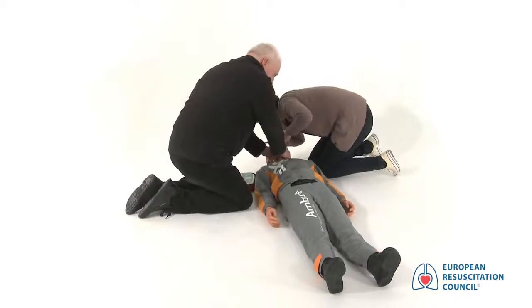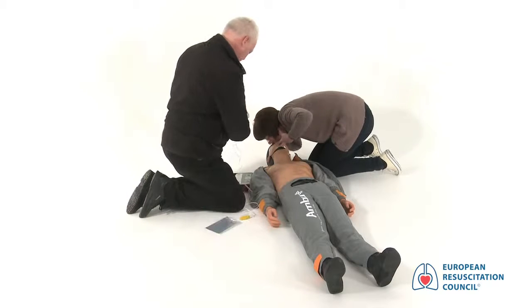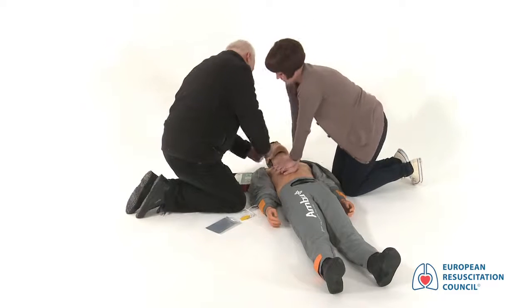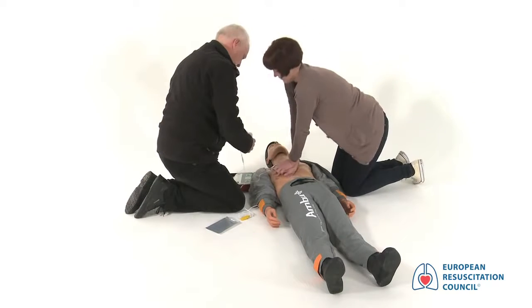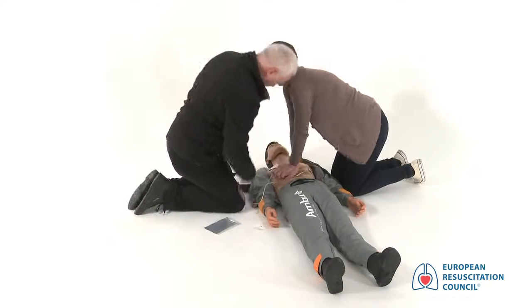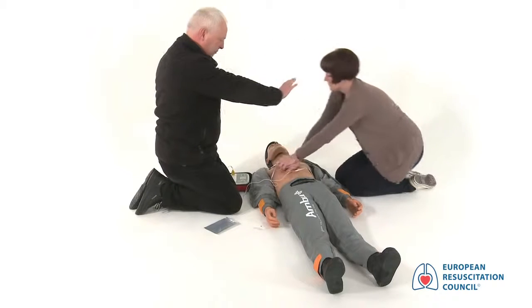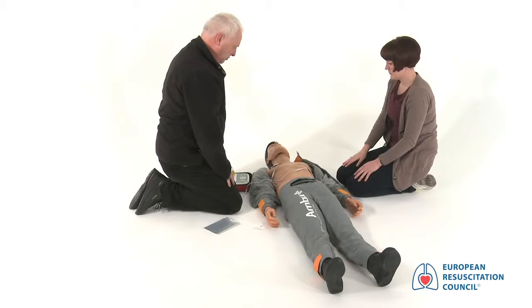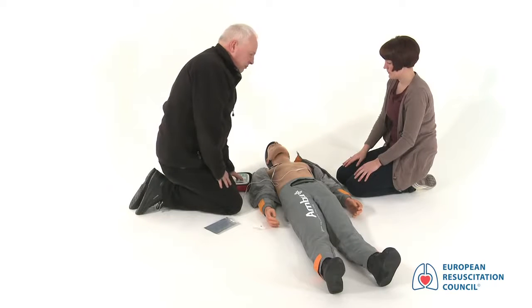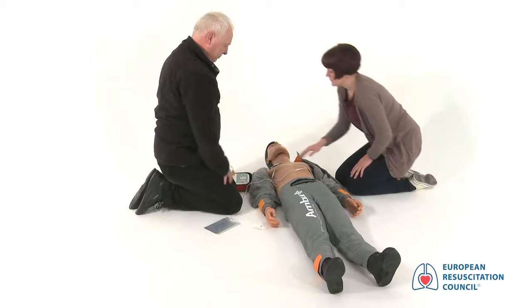Apply pads to patient's bare chest. Plug in pads connector next to flashing light. Analyzing heart rhythm. Stand clear. Do not touch the patient. Shock advised. Charging. Stay clear of patient. Deliver shock now. Press the orange button now. Stand clear. Shock delivered. Go on. Begin CPR.